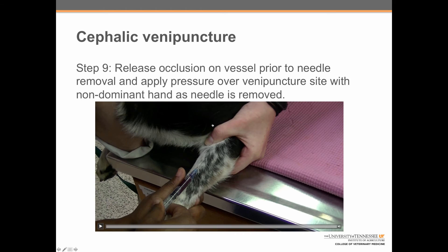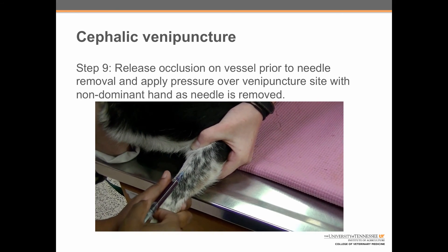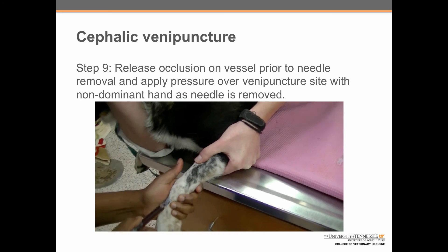Finally, step nine: instruct the handler to release occlusion on the vessel prior to needle removal, then apply pressure over the venipuncture site with the non-dominant hand as the needle is removed. Although in this video the handler applies pressure to the venipuncture site, it is generally recommended that the person drawing the blood apply the pressure — that way there is no risk of anyone getting stuck with the needle.